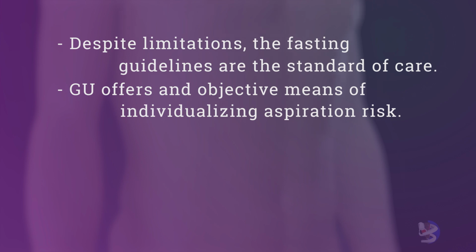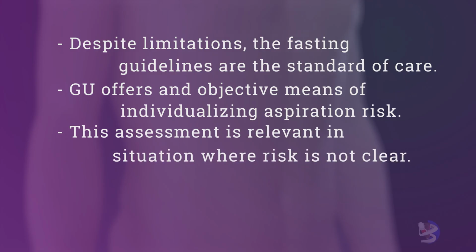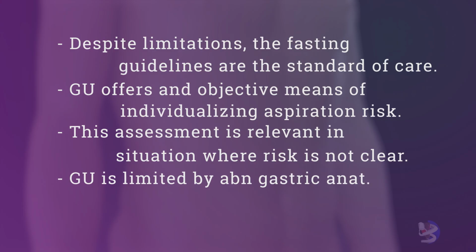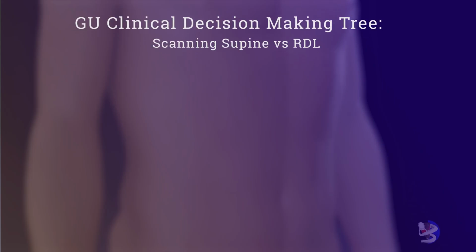As per Dr. Van de Put and Dr. Perlas, this will be patients who have not followed the fasting guidelines or due to the urgent nature of the clinical situation. It can also be used in those who have delayed gastric emptying, such as those with critical illness, diabetic gastroparesis, etc. Gastric ultrasound can also be used in those who have an unreliable history. Remember that the technique may not be accurate for those with abnormal gastric anatomy, and some patients may have poor gastric ultrasound windows.